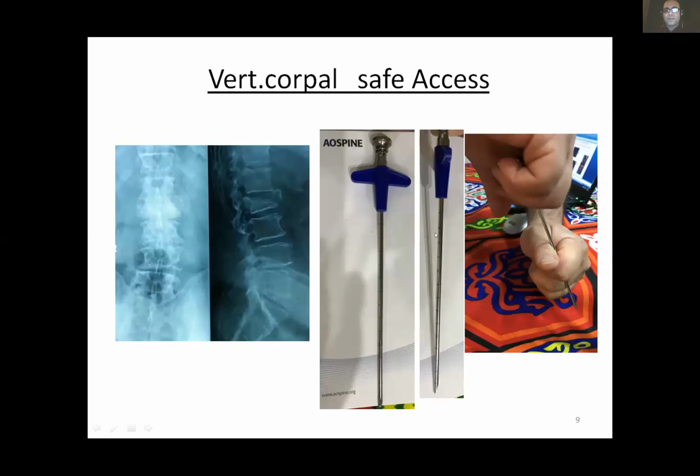And of course, one of the most important tips is to avoid soft tissue injury and avoid progression of the needle into the soft tissue, so you use a rocking motion. If you are right-handed, with the right hand you grip and hold the needle from the top and do the rocking motion, and with the left hand you stop it and support the needle in order not to go further inside the patient's soft tissue.